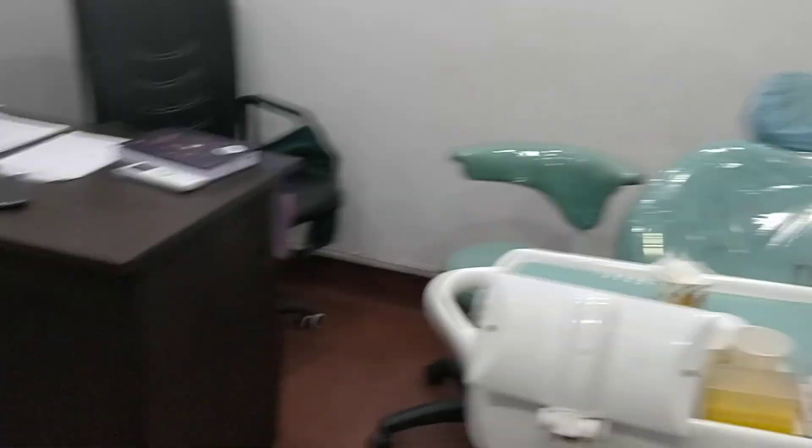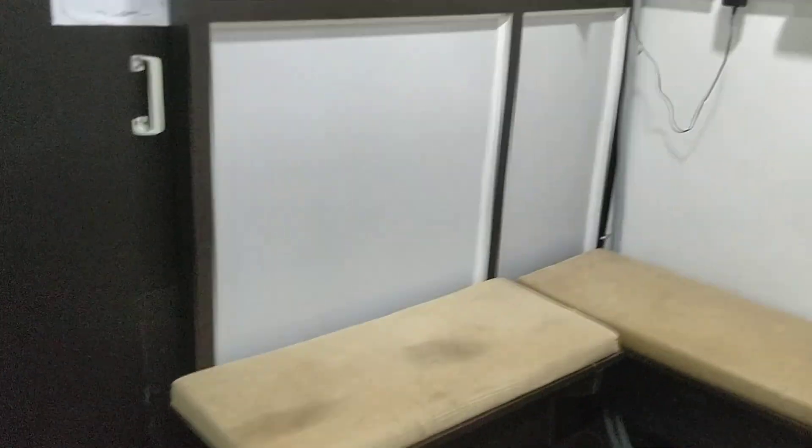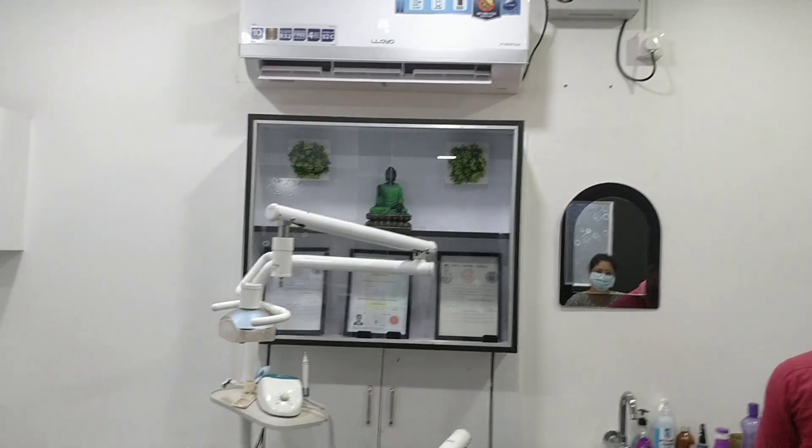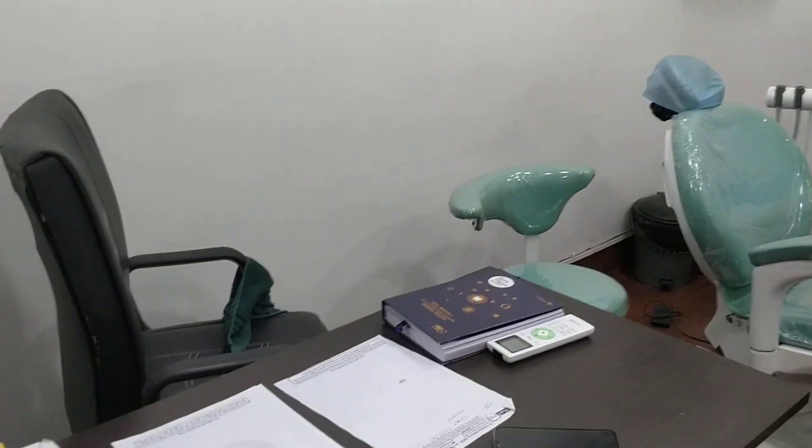This is the laptop which is here, and I have installed the RVG sensor Vatech. This is one dental chair, this is another one, and this is the waiting room and the cleaning room. That's all for today's video — it was just a small and simple walkthrough of my clinic. This is the place where I walk and this is the place where I sit.